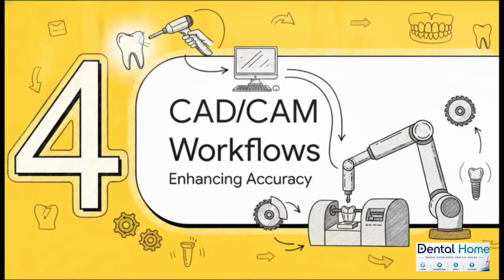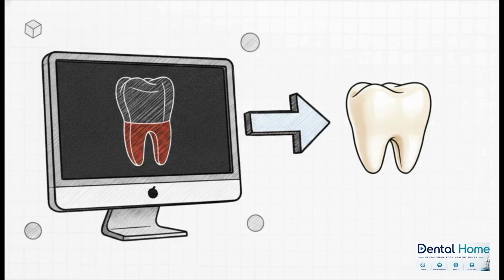All right, shifting gears a bit for Section 4, enhancing digital CAD/CAM workflows. We are obviously living in an era of incredible digital CAD/CAM technology. Dentists scan mouths with highly accurate lasers, and technicians design teeth using super advanced software like Exocad and 3Shape. But here is the absolute crucial point. These digital workflows rely completely on a clear, physically possible insertion path.